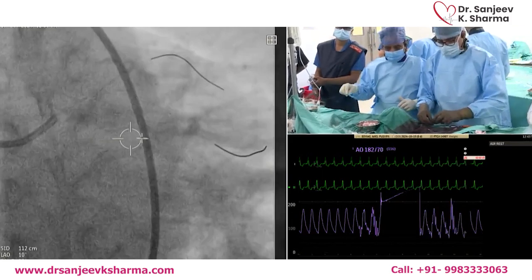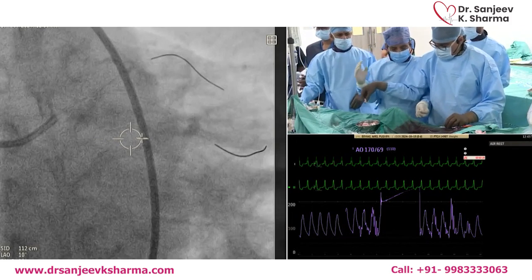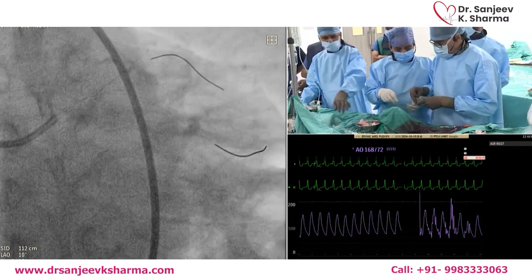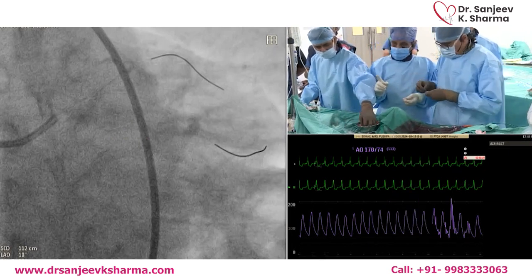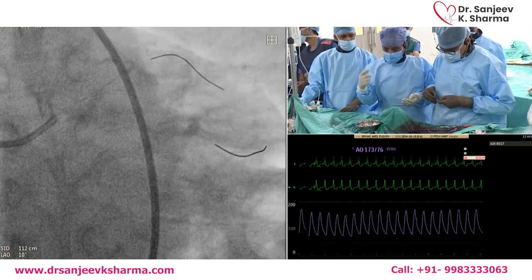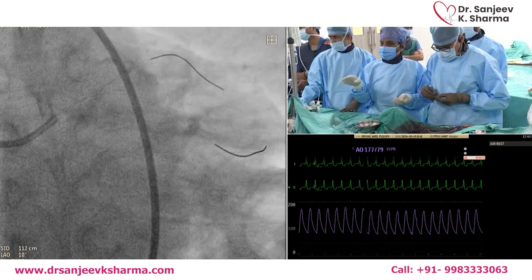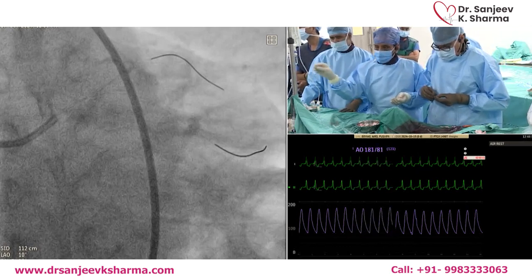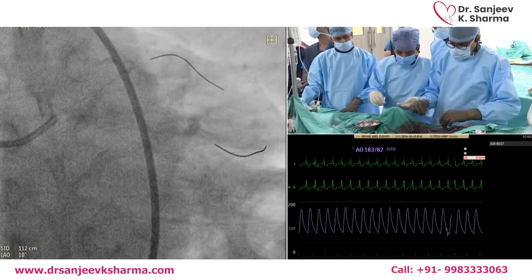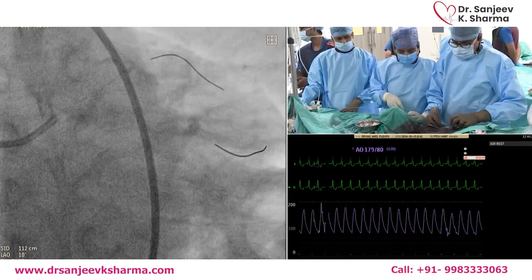So it's 25 seconds. That's a feature. It's 25 seconds. So you have to prime in your mind, just like with Rota, where we usually do 20-second ablations. Same thing, it's 25 seconds, but the 25 seconds has to involve coming back also. So you have to put a kind of timer in your mind, not only 25 seconds going forward. Compared to rotablation, where you do pecking, here you can do gradual advancement. No pecking needed, gradual advancement, 1 millimeter per second. But at 25 seconds it will make the noise.